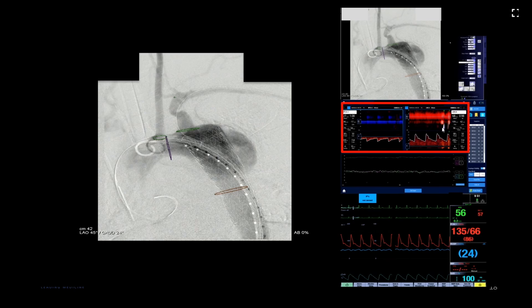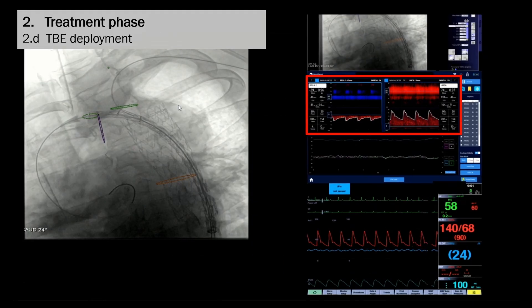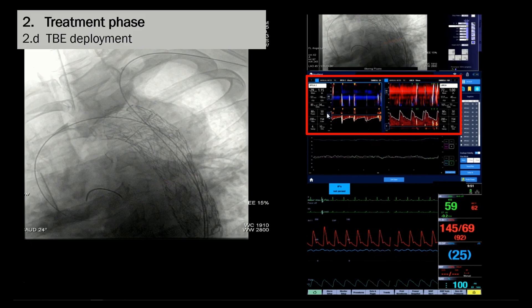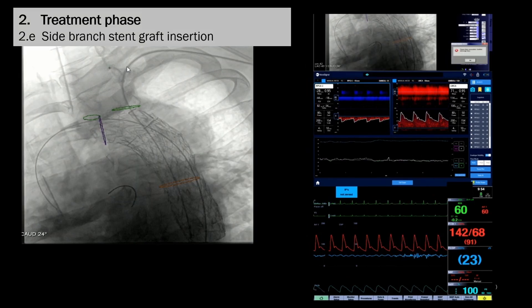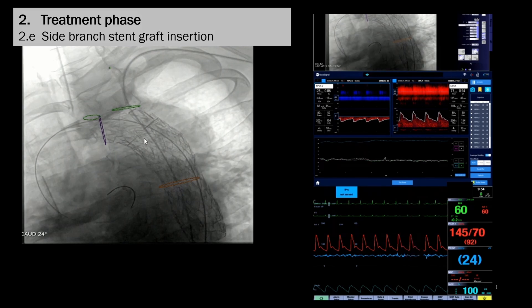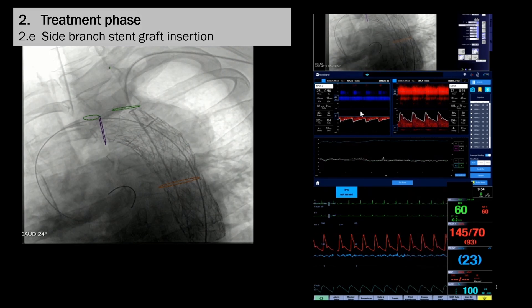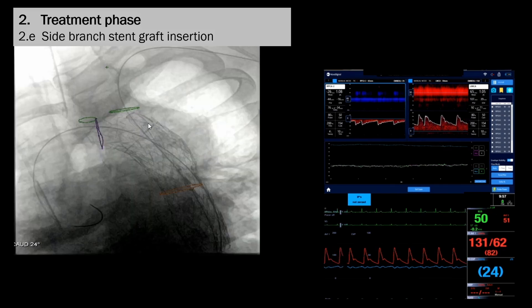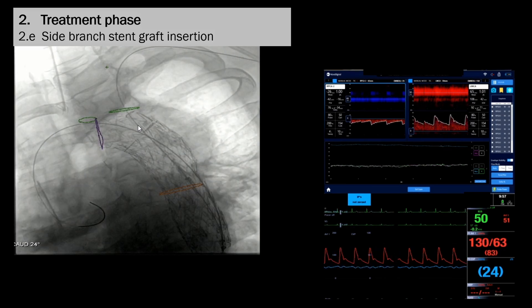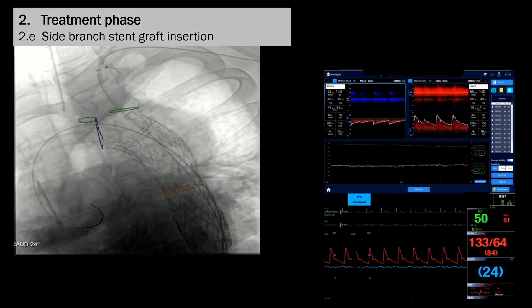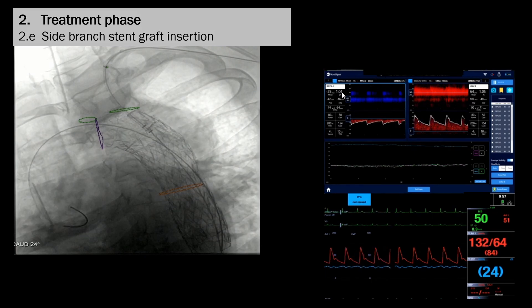On the TCD screen, we can see brightening in the M-mode and the waveform in the left middle cerebral artery. The deployment of the TBE is causing bilateral hits in the left middle cerebral artery and the right posterior cerebral artery. Otherwise, no significant blood flow changes are seen on the TCD screen during the deployment of the TBE. A six-French sheath was introduced from the left radial access through the TBE portal into the descending aorta, and no hits were seen in the right PCA during this phase.